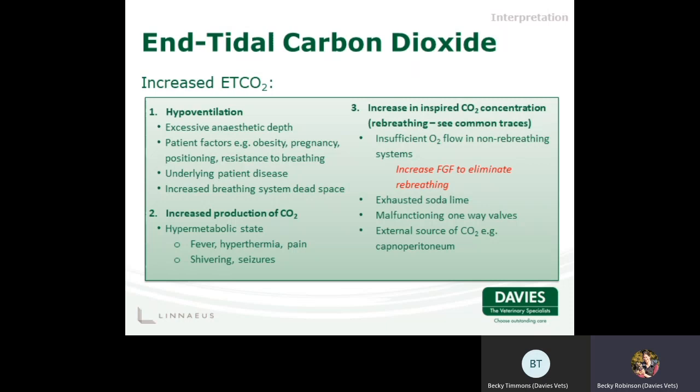So we can see here the main reasons why a patient may be suffering from hypercapnia, or that is an increased end-tidal carbon dioxide. This is most commonly due to hypoventilation, which can occur due to a number of different reasons, including excessive anaesthetic depth, underlying patient disease such as cardiopulmonary, musculoskeletal and acid-base disorders, or patient factors including obesity, pregnancy and patient positioning.